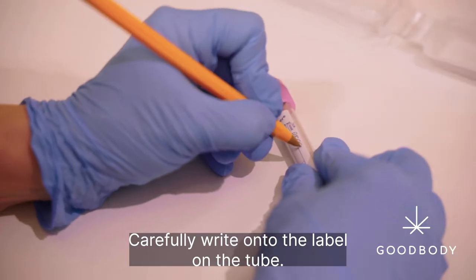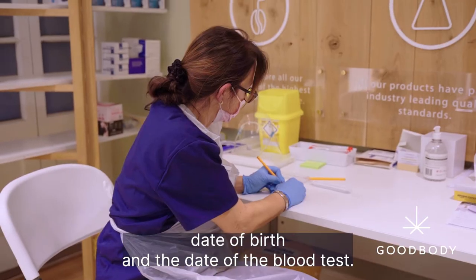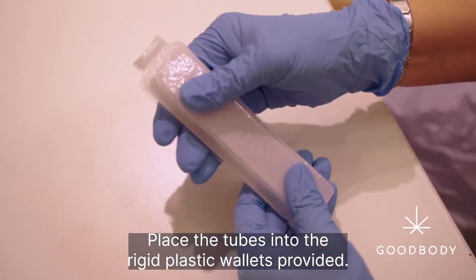Carefully write onto the label on the tube the patient's full name, date of birth and the date of the blood test. Place the tubes into the rigid plastic wallets provided.